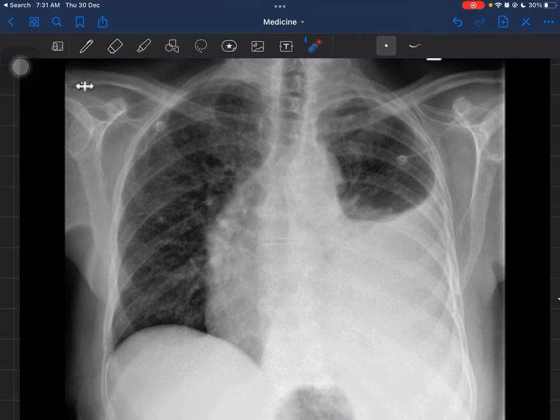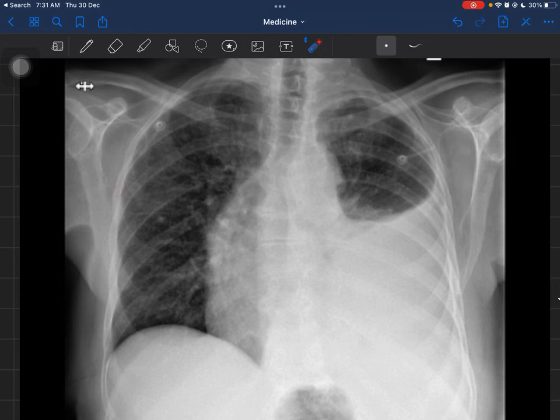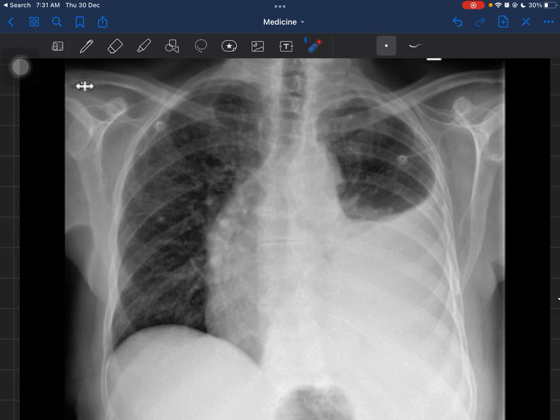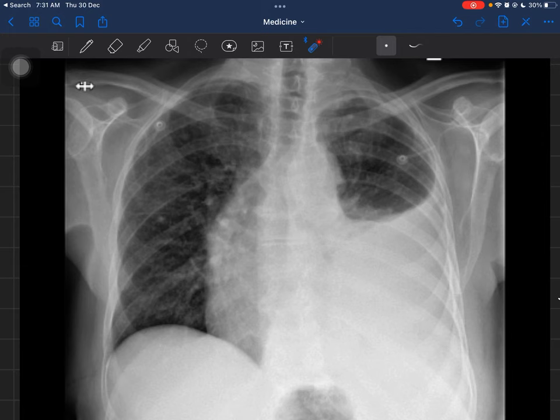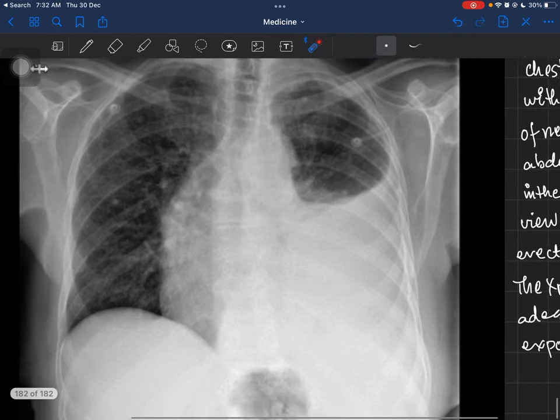For Bones, look at the ribs. Count the anterior ribs on the right side: first, second, third, fourth, fifth, sixth, and approximately half of the seventh rib — so about six and a half anterior ribs are visible. Similarly on the left side you can count up to about seven ribs. Six to seven anterior ribs visible means this X-ray was taken in deep inspiration.